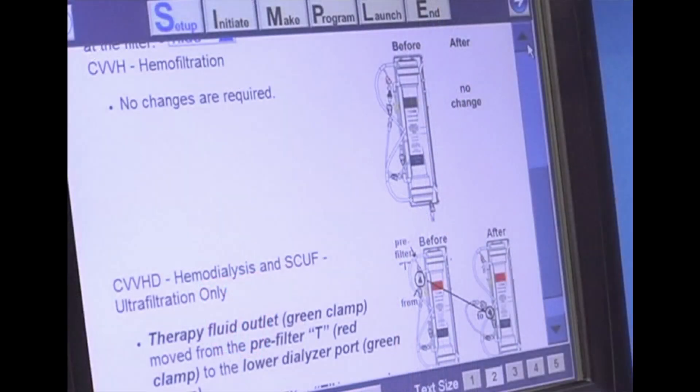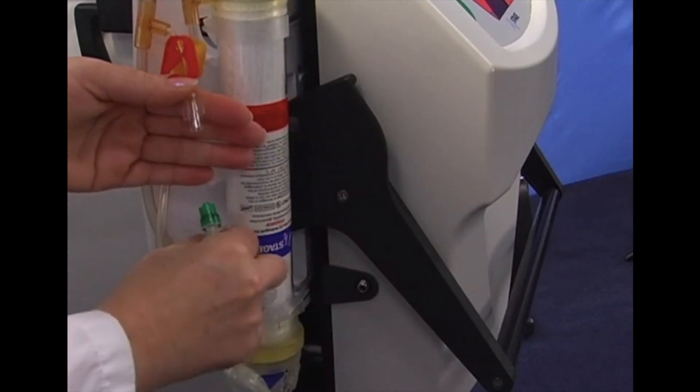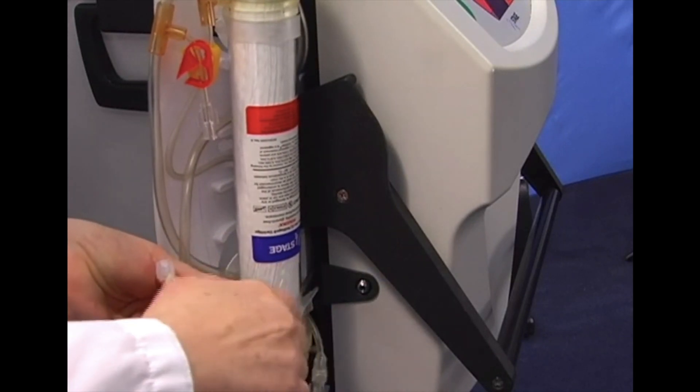Based on the therapy prescription, confirm the therapy fluid connections at the filter. The cartridge is already configured for CVVH — you do not need to make any changes. For CVVHD or SCUF, remove the green therapy fluid outlet line from the pre-filter T to the dialysate port and cap the pre-filter T. Make sure your clamps are open.